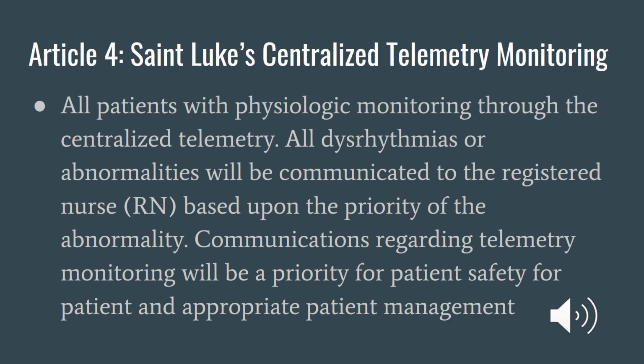For our fourth and final article, we reference St. Luke's centralized telemetry monitoring policy, which pertains to all patients with physiologic monitoring through the centralized telemetry. All dysrhythmias or abnormalities will be communicated to the registered nurse based upon the priority of the abnormality. Communications regarding telemetry monitoring will be a priority for patient safety and appropriate patient management.